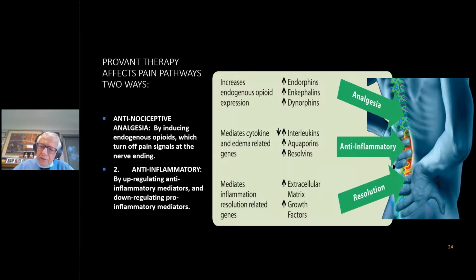I think interesting to note again in that Sorrell study that I just showed, how tweaking the energetics from 42 to 38 microsecond caused such a dramatic difference in terms of the CRP, or the inflammatory biomarker. So at 42 it decreased, at 38 it increased significantly.